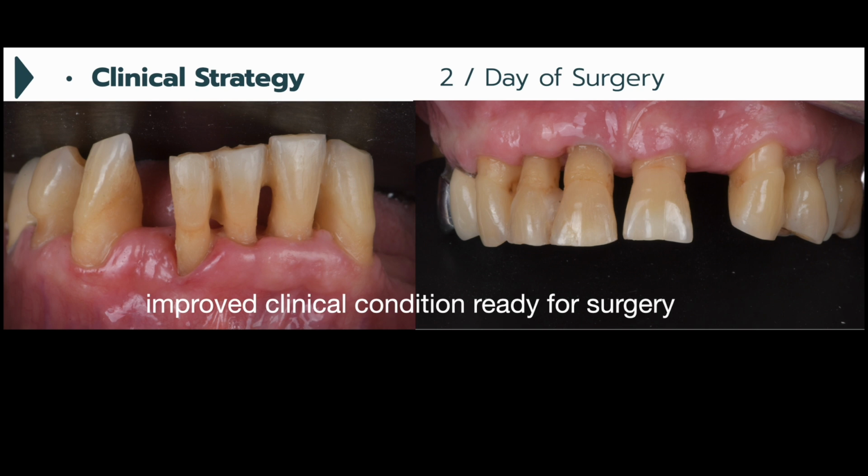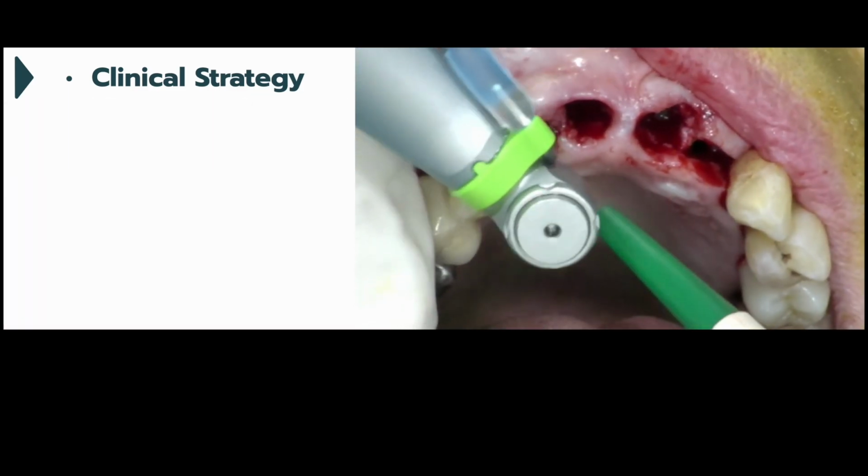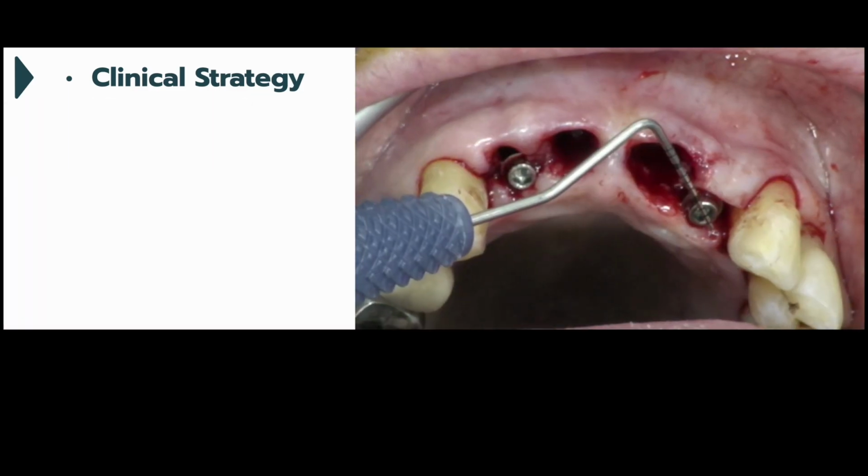Look at the quality of the periodontal. Exactly. This is improved by the scaling, by the patient, so that now we can work in good condition. You mean periodontal therapy works? In the south of France. And then we go for the surgery.